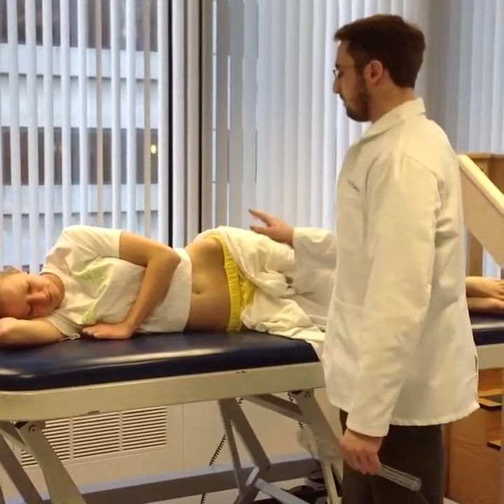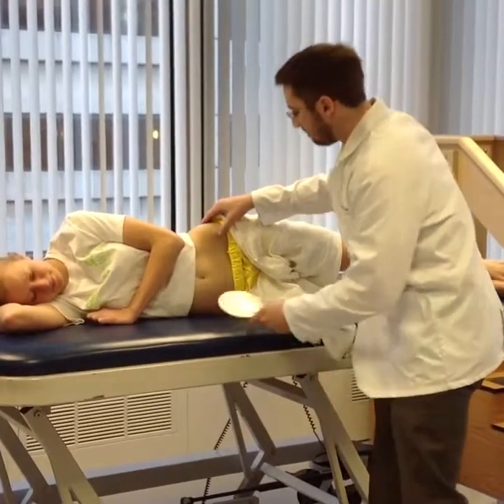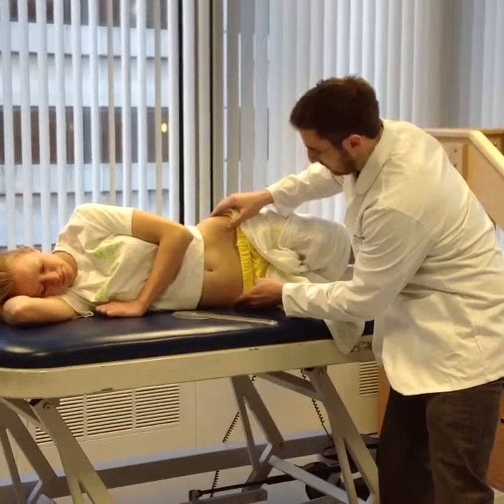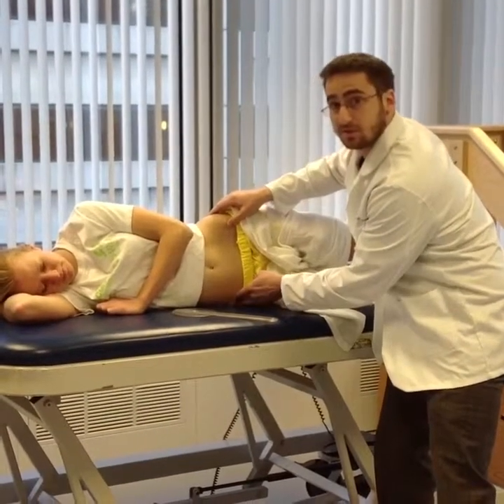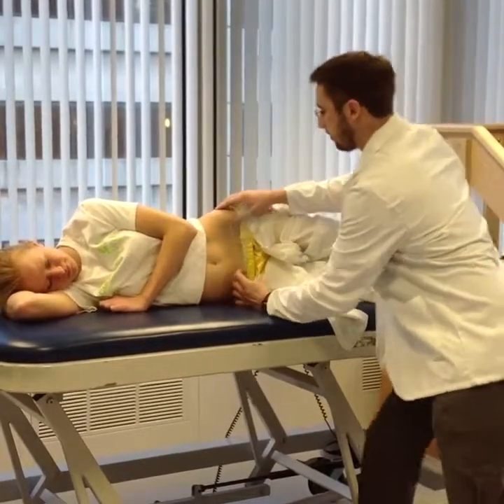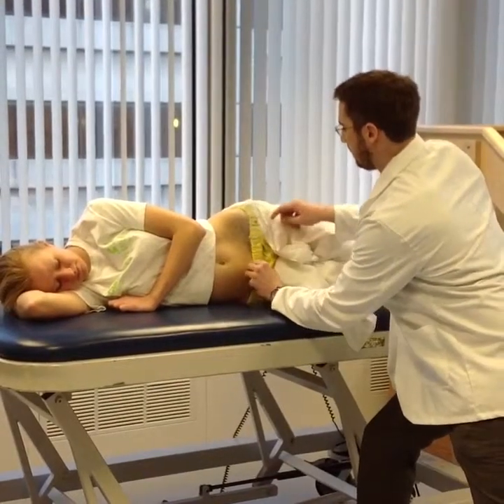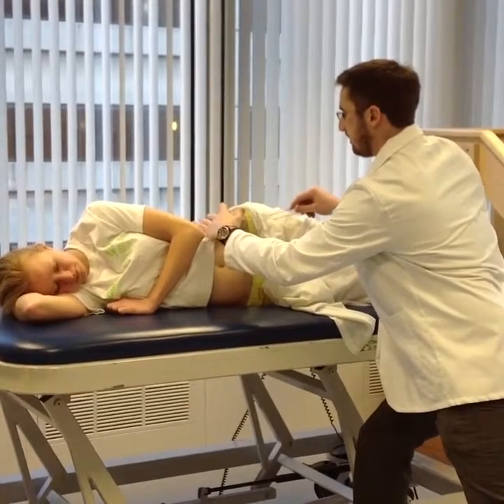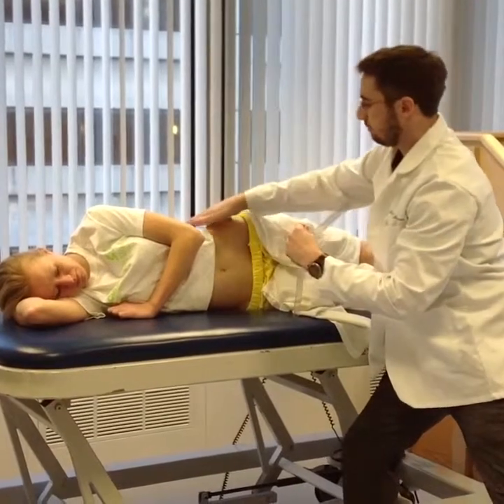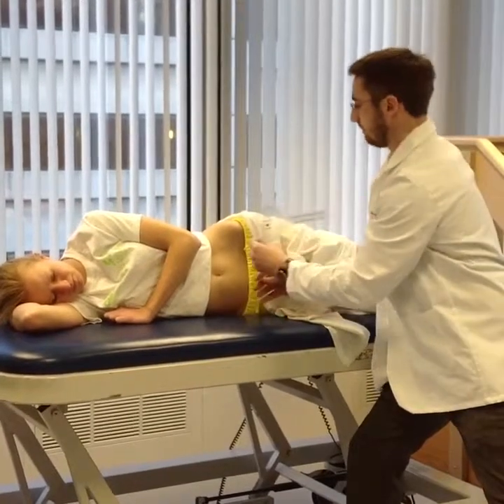I'm going to palpate your ASIS, which is the little bump here on your hip. So I'm just going to make sure I have the proper landmark. This ASIS is the axis of the goniometer, and the stationary arm is pointed to the opposite ASIS. I've got the landmarks. I'm going to squat down a bit, and I'm going to try to keep my hand here so I can make sure I feel for end range, which is going to be movement of the ASIS — when you can no longer abduct the hip using just the femur.